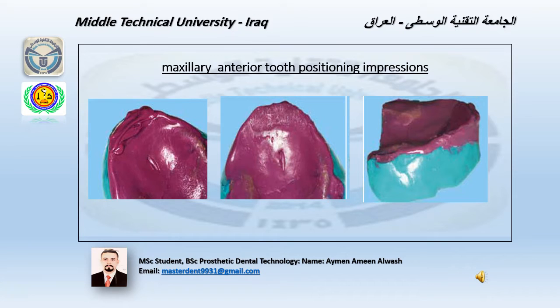These two sounds will record the action of the upper lip. The action of the upper lip will be recorded at the labial aspect of the special tray.